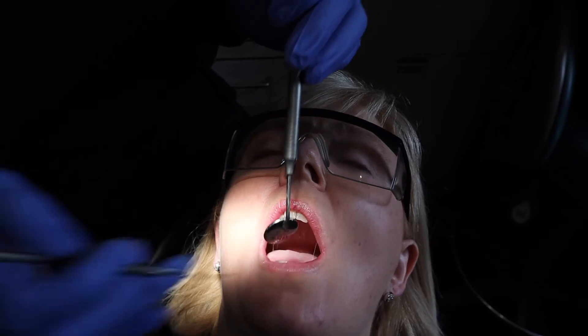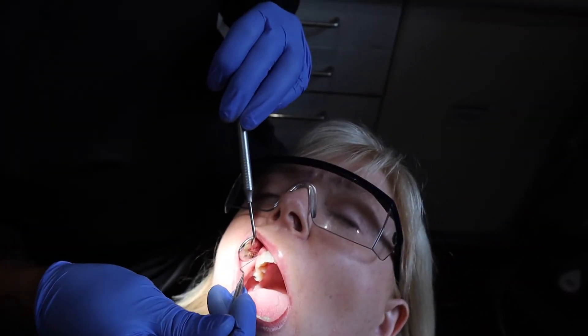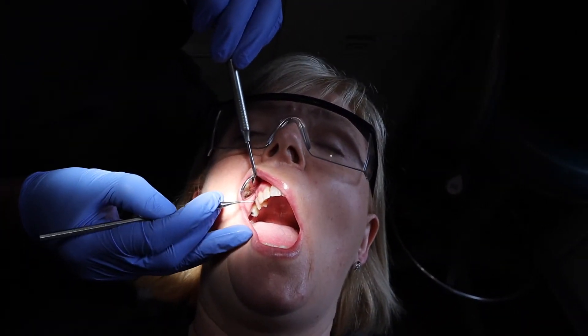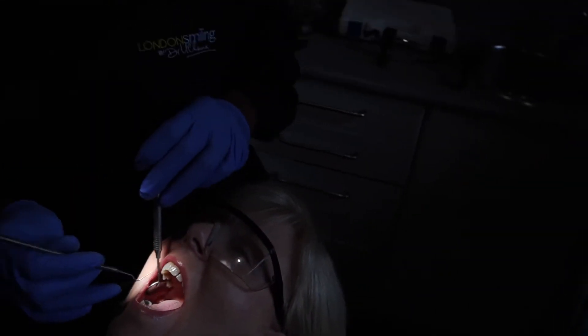Are your gums bleeding at the moment when you brush? No. Okay. So as you can see, I've just cleaned a little bit of plaque there and there's just bleeding going on. And I think you can tell everybody I didn't hurt you. Absolutely not, it's not.